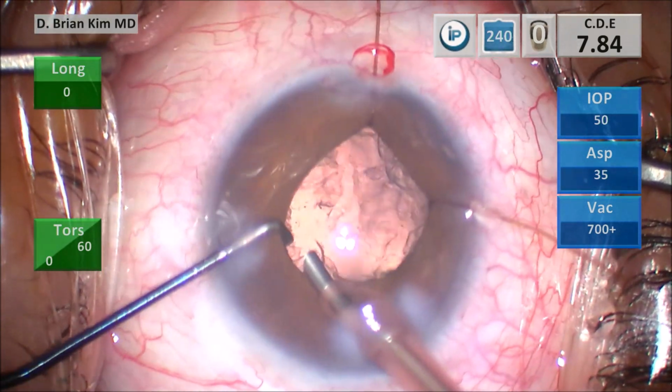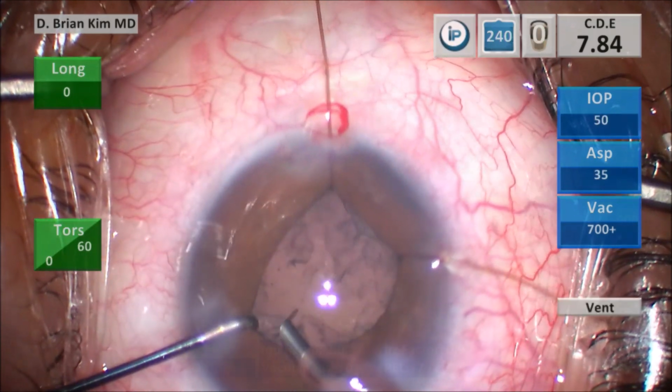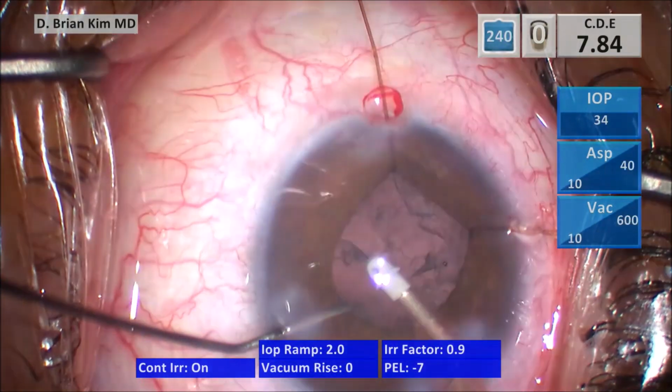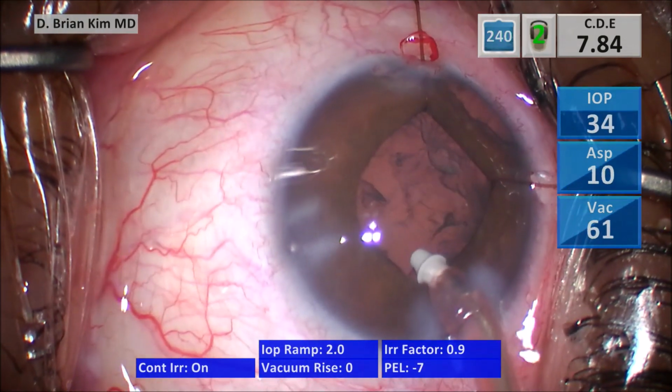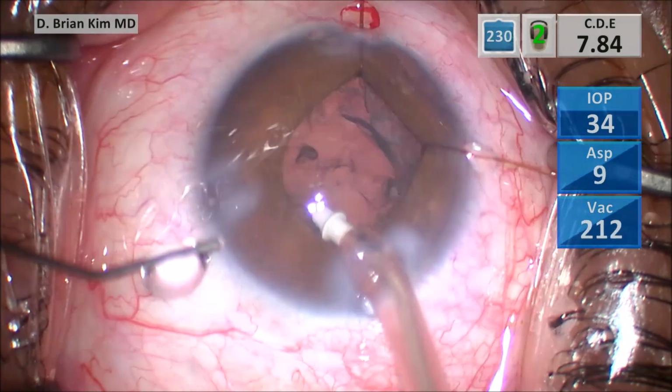I'm trying to be very careful not to initiate any vacuum in the situation that can increase risk for complications. So I go ahead and stop, but in my mind, I'm pretty sure there's a piece hiding there, and so you'll see later on how I investigate that.